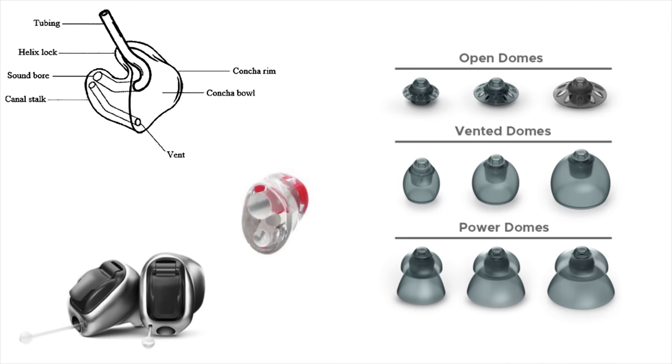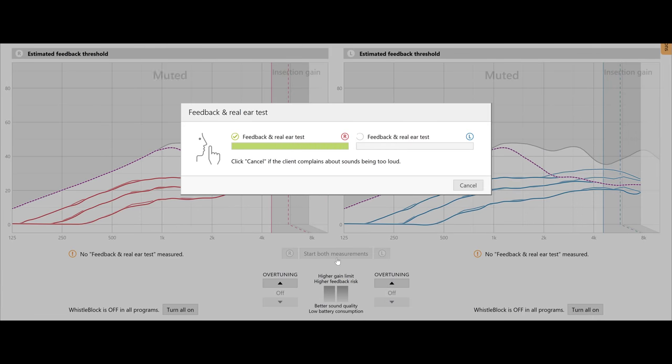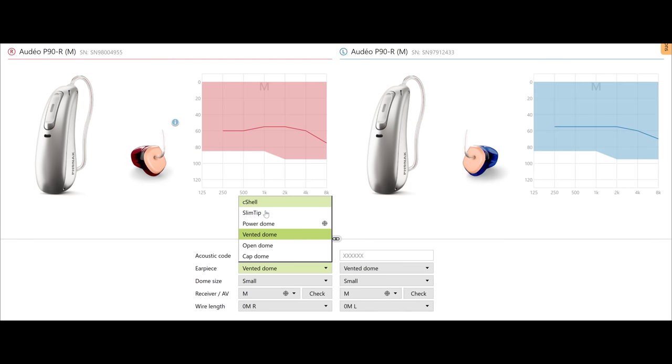Once that's set up, you'll want to do a feedback verification test inside the software while wearing the hearing aids. This tells you if the ear mold vent or rubber dome style you're using are acoustically acceptable. The test measures how much sound leaks outside your ears and recycles back through the microphone. Too much leakage can restrict amplification or cause whistling, meaning you'll need to reduce the vent size or change the dome. Conversely, trapping too much sound can cause the occlusion effect, where your voice sounds boomy and loud to yourself.